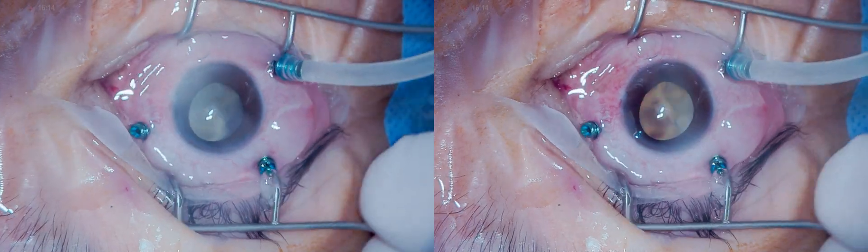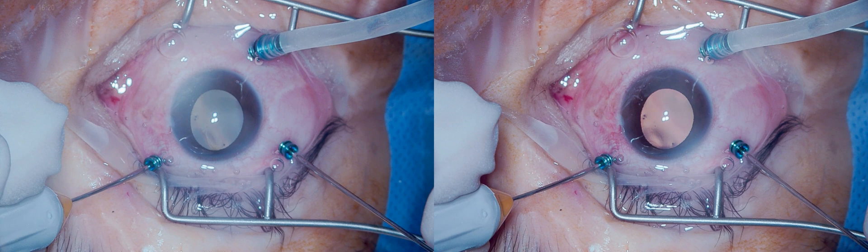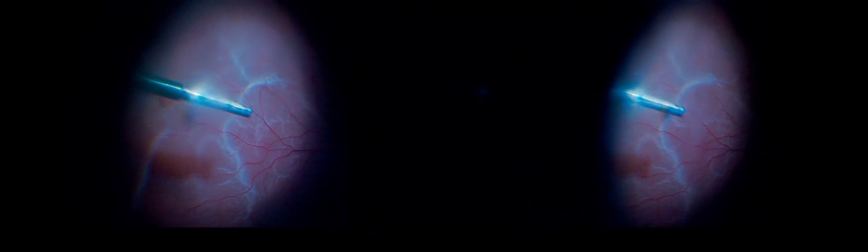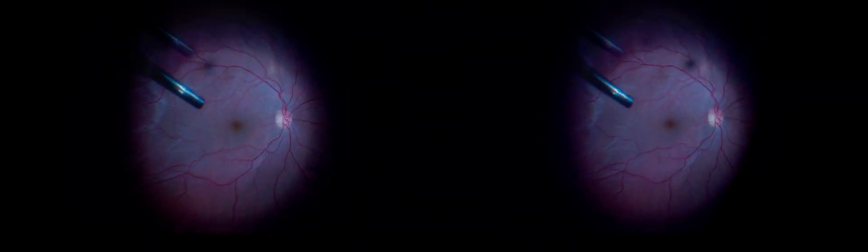Subretinal PVR is evident and the retina should be separated from its vitreous connections. A peripheral retinotomy is created and extended upwards and downwards. You may notice here the visualization from the macula to the far periphery where you see the PVR.